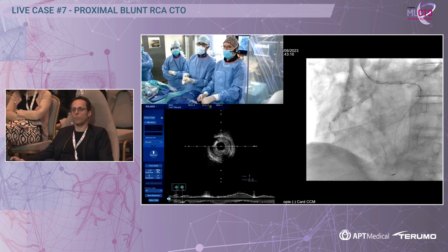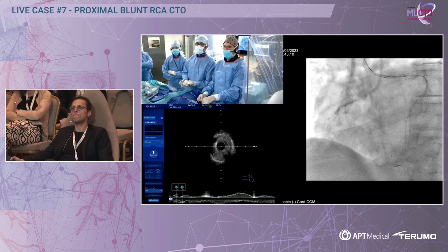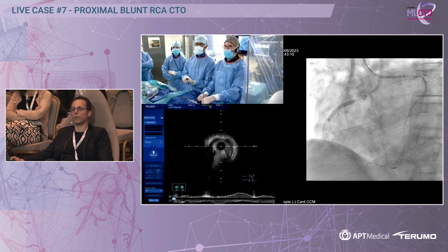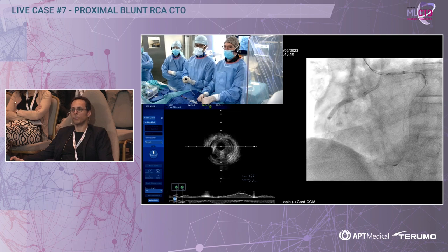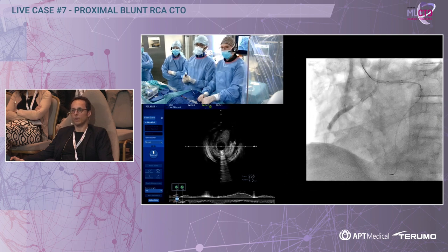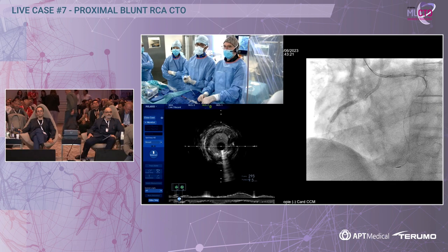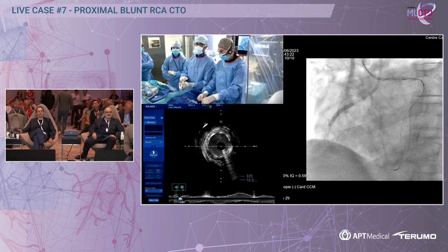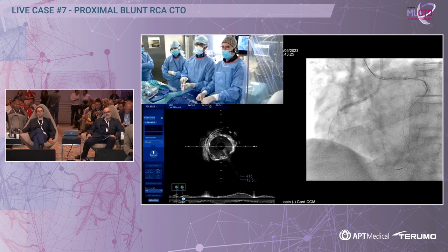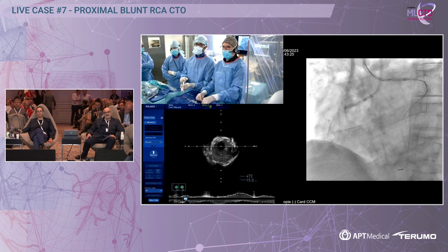So we used a Sapphire 3.5 non-compliant, 28 mm balloon. We will show you now the final result.